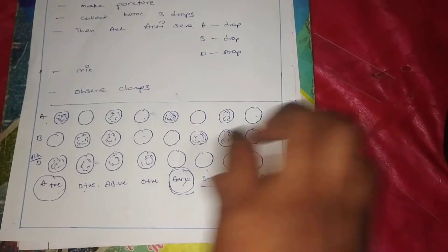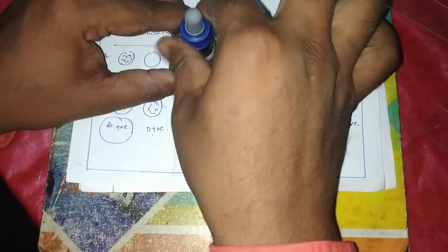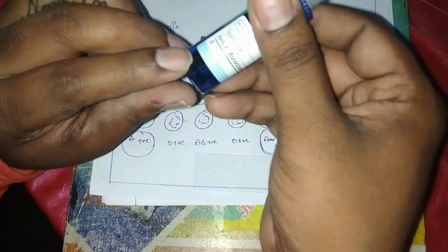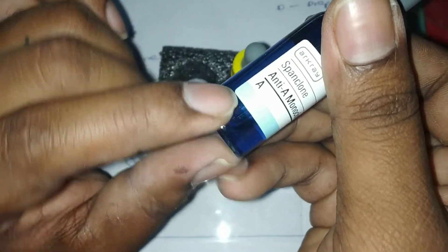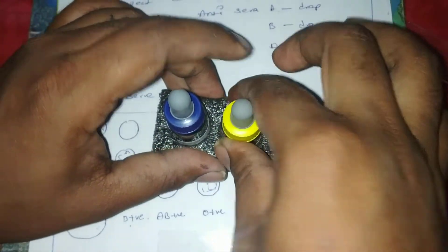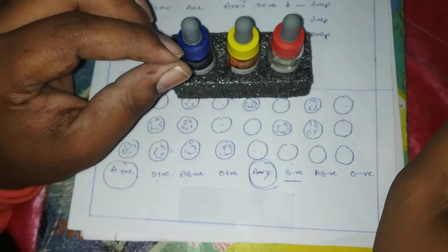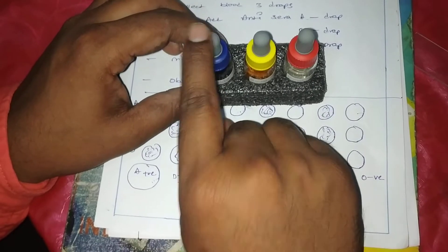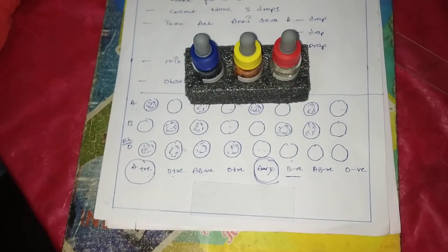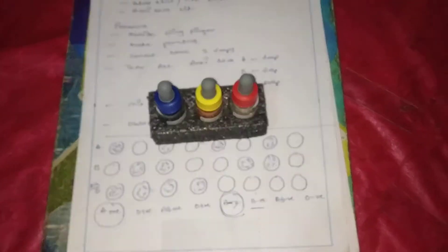Let's perform the practical. Take one fresh glass slide. Always keep your kit in this order: this is A, this is B, and this is D. The stickers are labelled — here it is written A, here B, and here D. First we will collect blood from the patient — three drops — then add anti-sera A to one drop, B to one drop, and D to one drop. Then mix it, check for agglutination, and give the report.